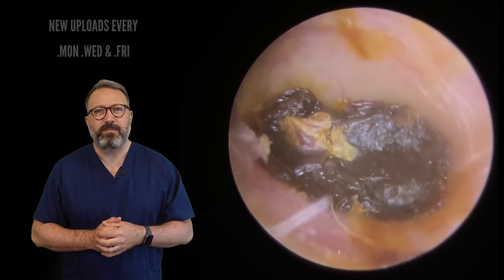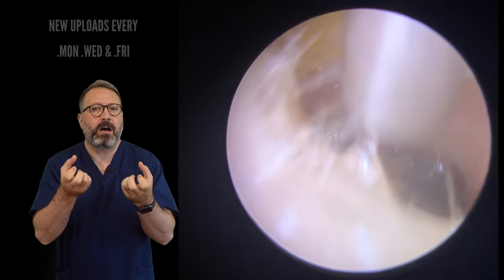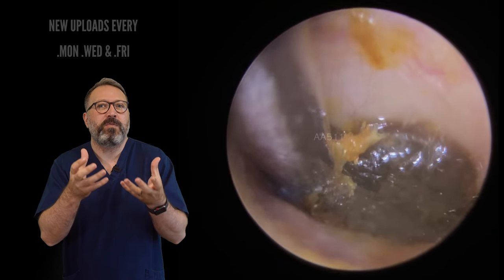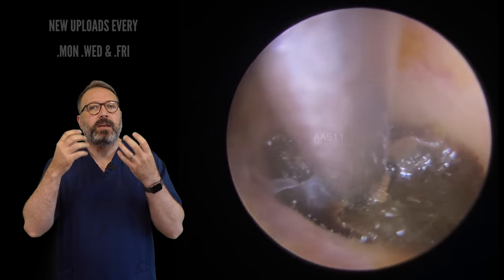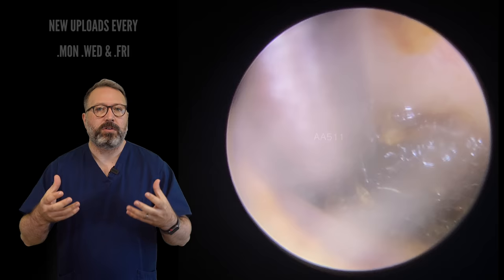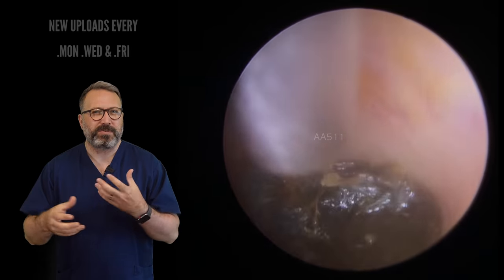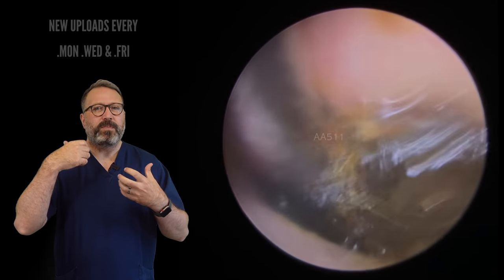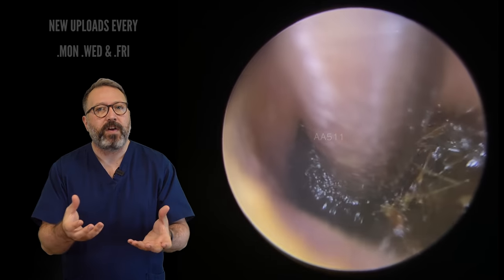Let's take a look at this main block. The first thing we'll notice is it's really shiny and it's very dark in color. The shiny part usually means this wax is very, very dry — or sometimes it can mean it's very, very wet. But in this case, it's really, really dry. The dark color means it's been in there a long time. Wax oxidizes over time. It's slightly acidic, with a pH of about 6. So it's antimicrobial, antifungal — it helps to fight off any bacterial or fungal infections in there.